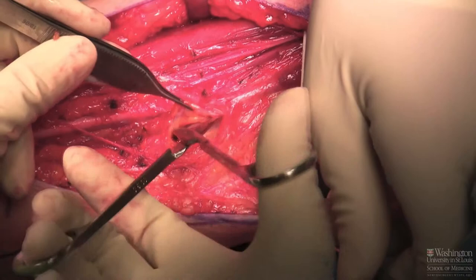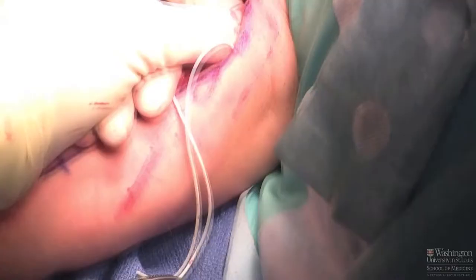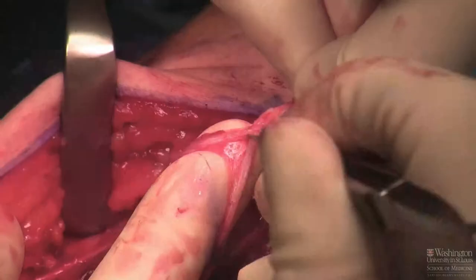Sometimes I'll follow it backwards just with surface anatomy from the medial aspect. I divide the musculocutaneous nerve proximally. Just before I do this, of course, I electrically stimulate to make sure there's no function in the musculocutaneous nerve. Then with micro-pickups, I neurolyze separately the three components of the musculocutaneous.